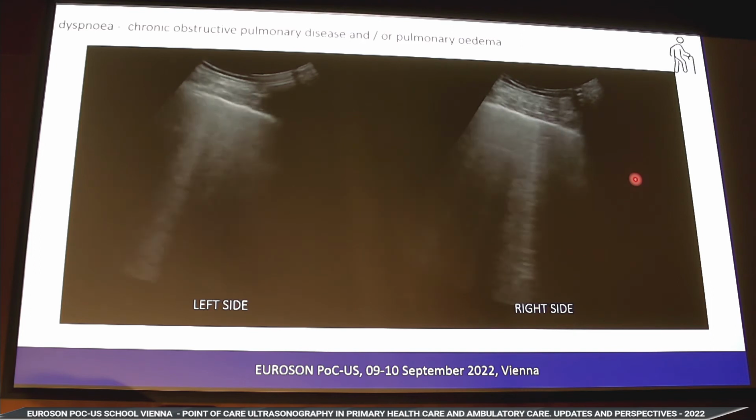But imagine the situation. As usual, you are on a home visit. You are holding your stethoscope to auscultate, and you've got your modern mobile stethoscope, a sonographic device. The patient has chronic obstructive pulmonary disease and cardiac insufficiency, and says he has dyspnea.